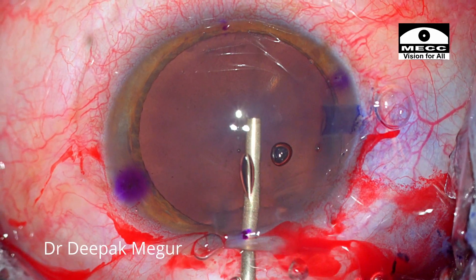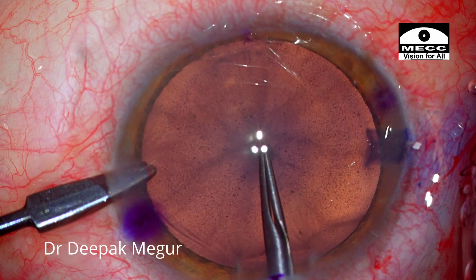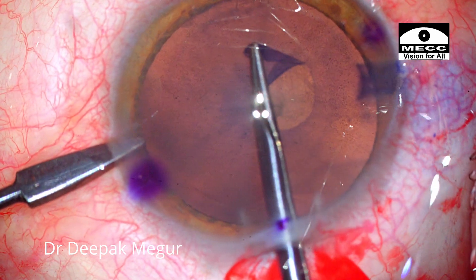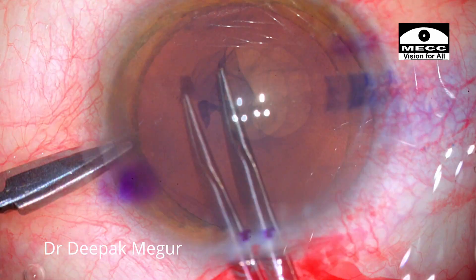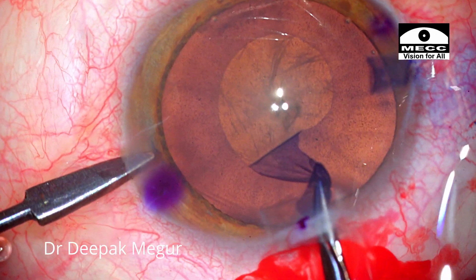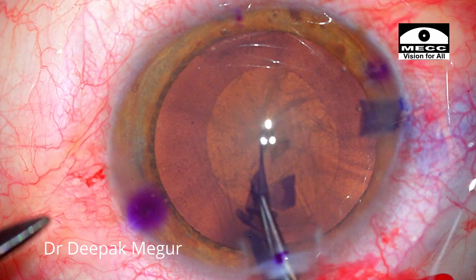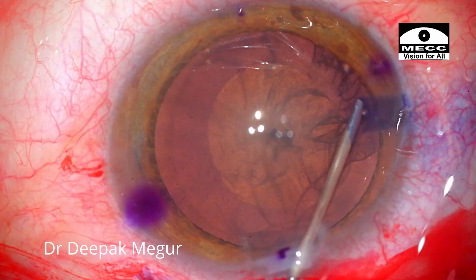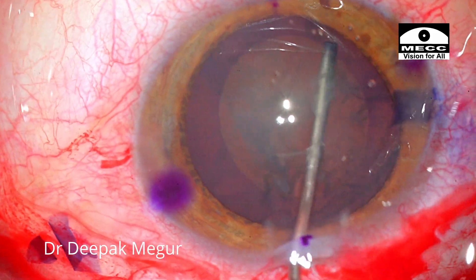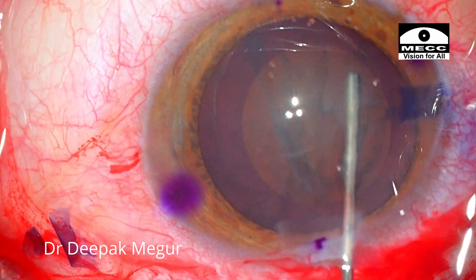Let's see how things work out. I am aiming at a 5 mm capsulorhexis which is centered around the Hirschberg reflex. Looks to be fine. Cortical cleaving hydrodissection is done to loosen up the cortex-nucleus complex, followed by hydrodelineation.